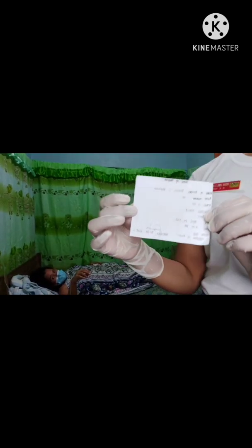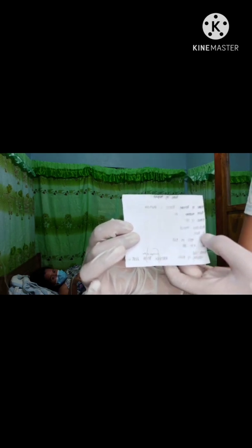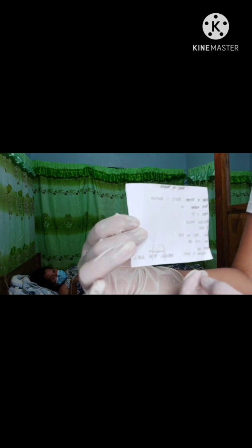After that, put the label. So this is the label. The name of the patient, the room number, the name of the IVF, the medication if infused; if it is none, we should write none. Then the IVF rate, the date today, and the time that it was inserted, and then the name and signature of the nurse that has been assisting the doctor. This one, we should put on the IVF bottle right here.